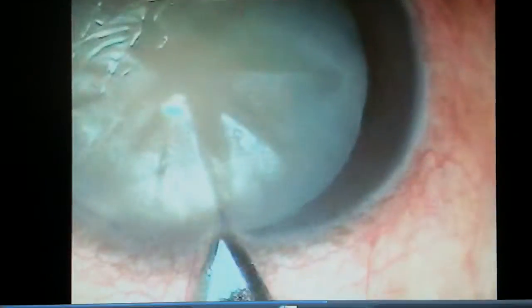Dear colleagues, I am going to show you how I do capsulorrhexis in a case of intumescent cataract. The anterior chamber is entered at 12 o'clock.